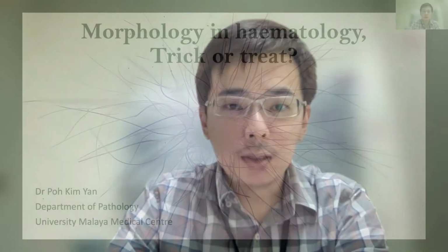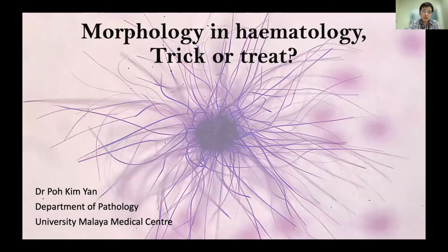So without further ado, I will share my PowerPoint. Okay, so the topic for today's CME is morphology in hematology. Is it a trick or treat? So before we start, this is a picture that I took from one of the peripheral blood film that we saw. Actually, this beautiful picture is actually a fungus or mold that looks so pretty under the microscope with all these undulating hairs coming out from the center.